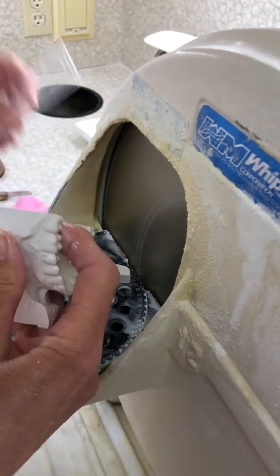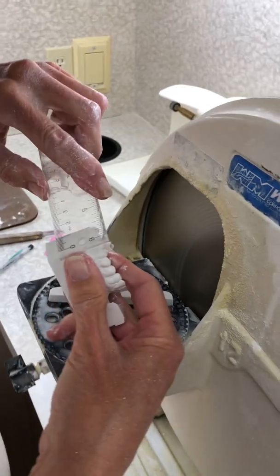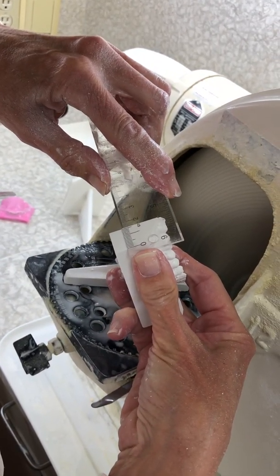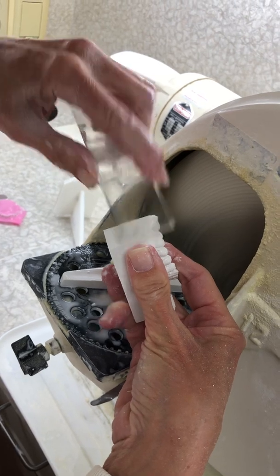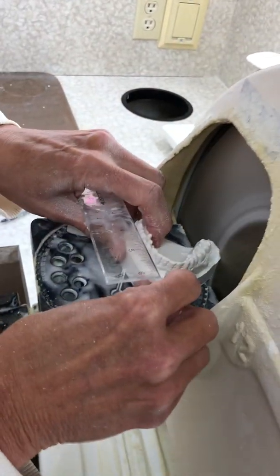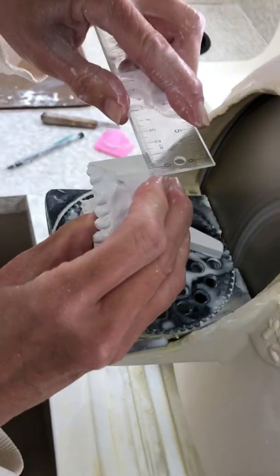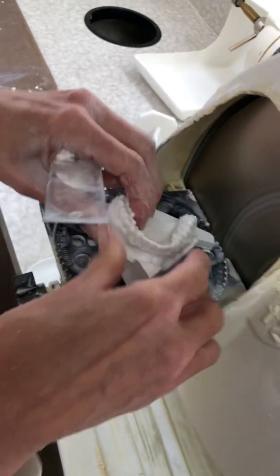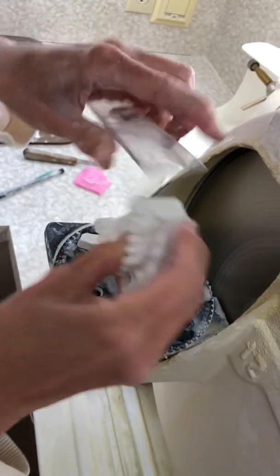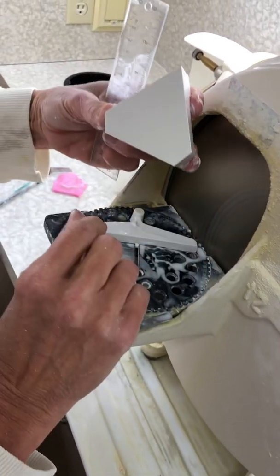Now, what I've done is I tend to measure. So when I measure this one, it's saying I'm at 16 millimeters. So what I can do is, in my head, I know approximately what that is. So buzz in, that should be close. Yeah, we're at 14, so we'll just do a little bit more. There we are at 16. So we're starting to get some symmetry at the back here now.